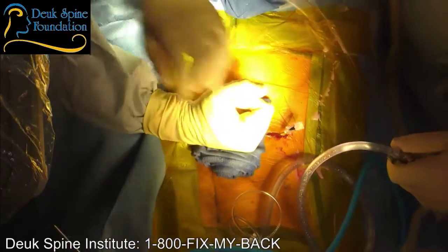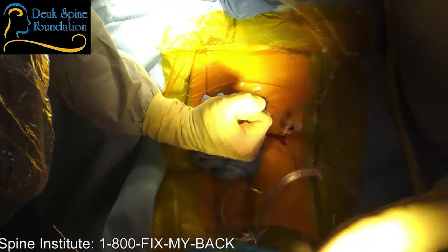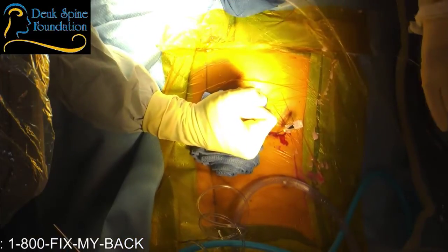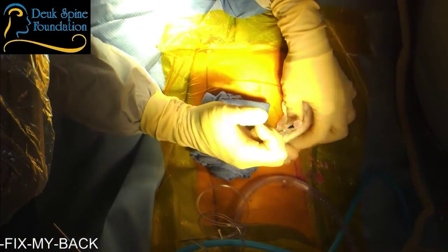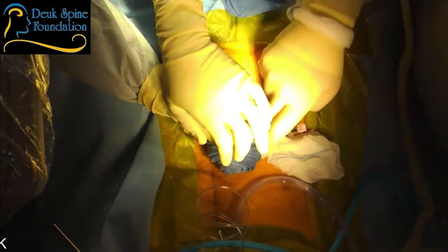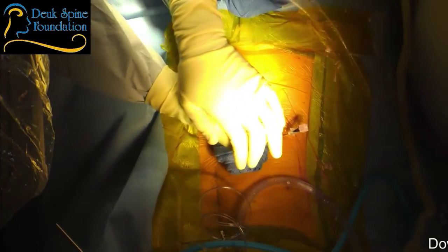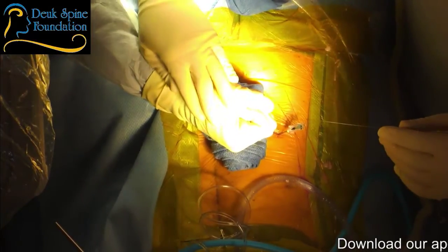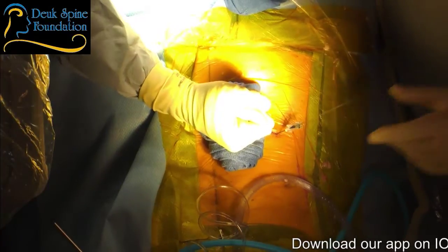For those of you who have been watching this wound carefully, you've noticed that we've only lost about 5 cc's of blood. If you think about it, a cc of blood is about 20 drops. So if we lost 5 cc's, we lost 100 drops of blood. It's really not much.